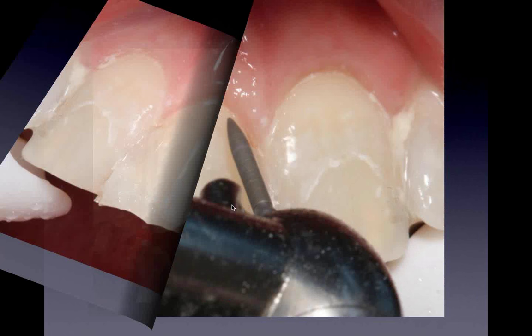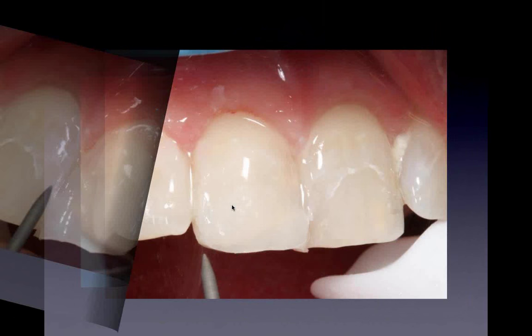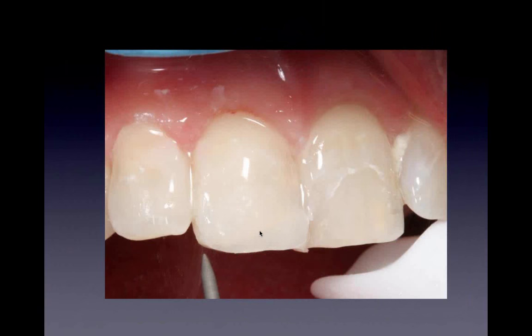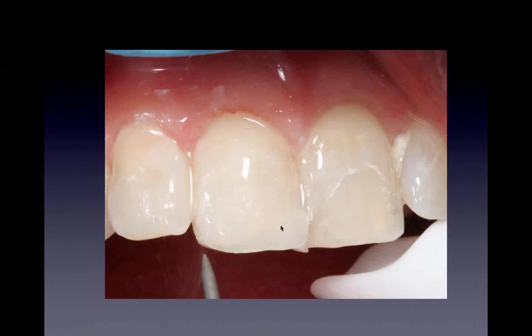So I'm polishing with the fine diamond. Then you see I added a different color here because I had too much trans. If you look at this area, it's too much trans here. So I cut it back and put a different layer of A1 instead of the pearl frost that I had. Sometimes you got to make those changes.